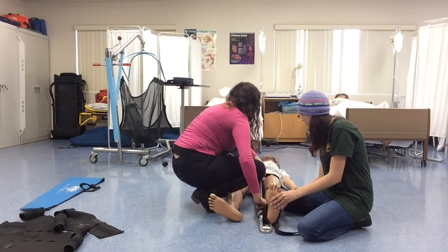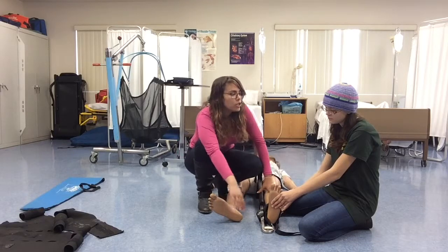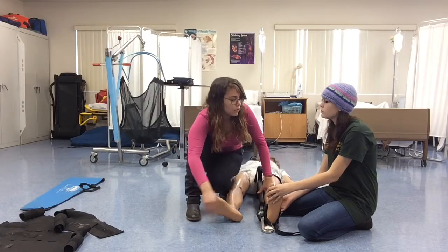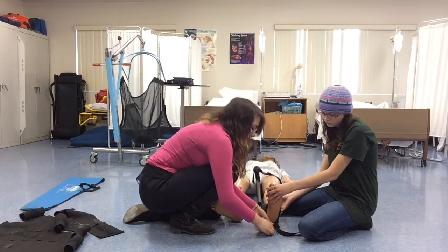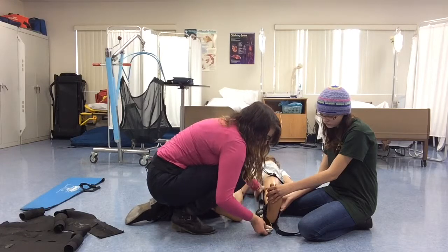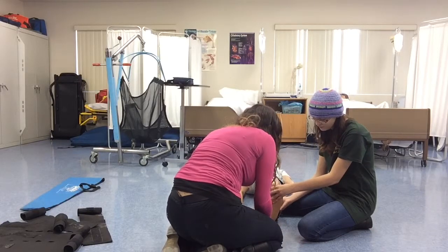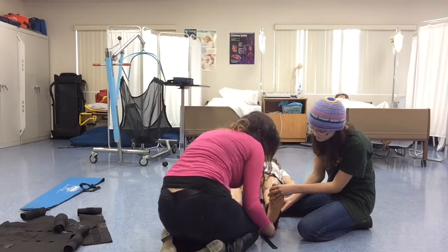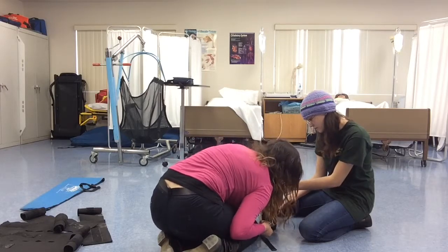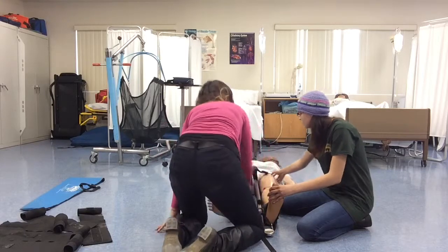Okay, so ma'am, how much do you weigh? 160? Okay, so my patient just says she weighs 160, but with a unipolar traction splint, we can't go more than 15 pounds. If she weighed less than 160, we would do 10% of her body weight. But because she weighs 160, I'm just going to pull for 15 pounds. This is hard. Okay, it's at 15 pounds now. I'm going to put it a little above so that when we pull traction, it doesn't lose.